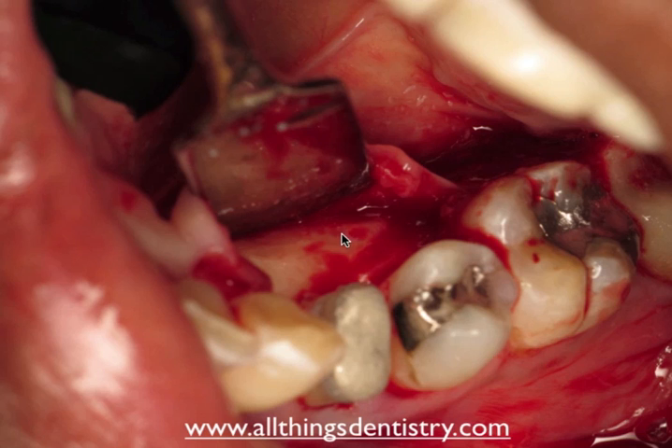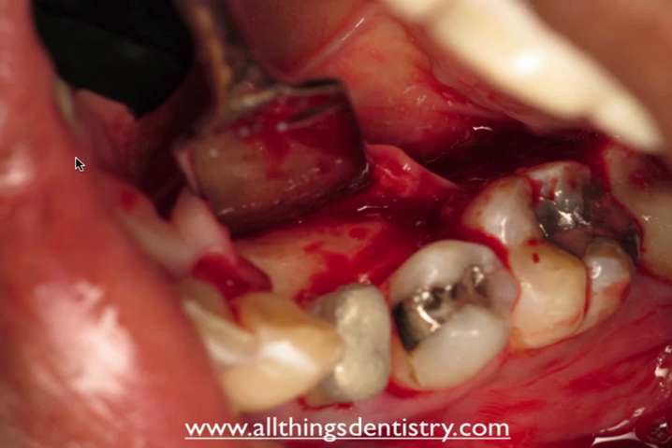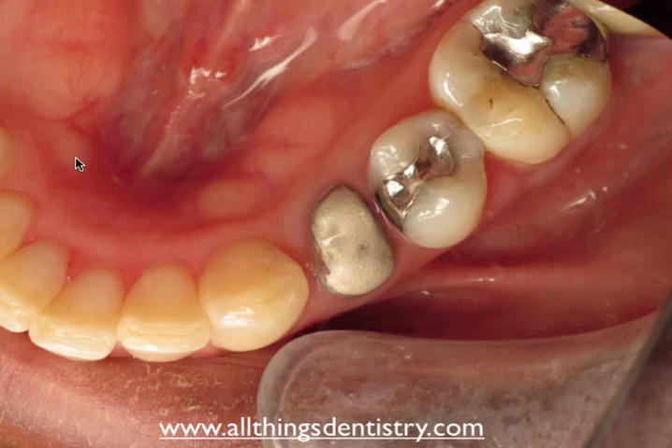Here is the final contour. In reflection, when you suture it actually looks a little bit sunken in, but from here it looks like we could remove some more. We smoothed out the osteoplasty, finished the remaining contouring of the osseous architecture, and then sutured using 5-0 Vicryl. You can see the flap is now nicely placed against the architecture, without that cratering effect and difficulty suturing. We did not treat the right side — the patient was asymptomatic and declined having that side completed.